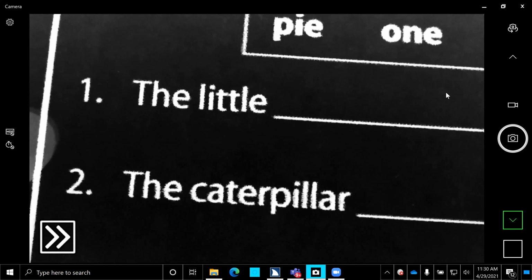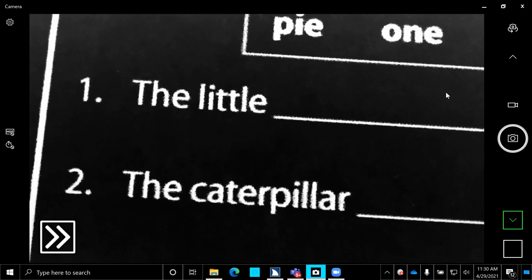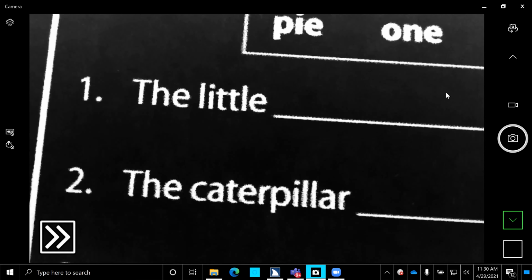So on the left side, I've got my top left corner, which is my power button. Beneath that is my color arrows that toggle me up or down to change my colors. So I only have 3 colors activated. I've got white on black, black on white, and true color. And I think I may have grayscale as well. But we've got a number of color combinations, blue on yellow, yellow on blue, all that kind of stuff that you can check and uncheck the ones that you want to be in the cycle.